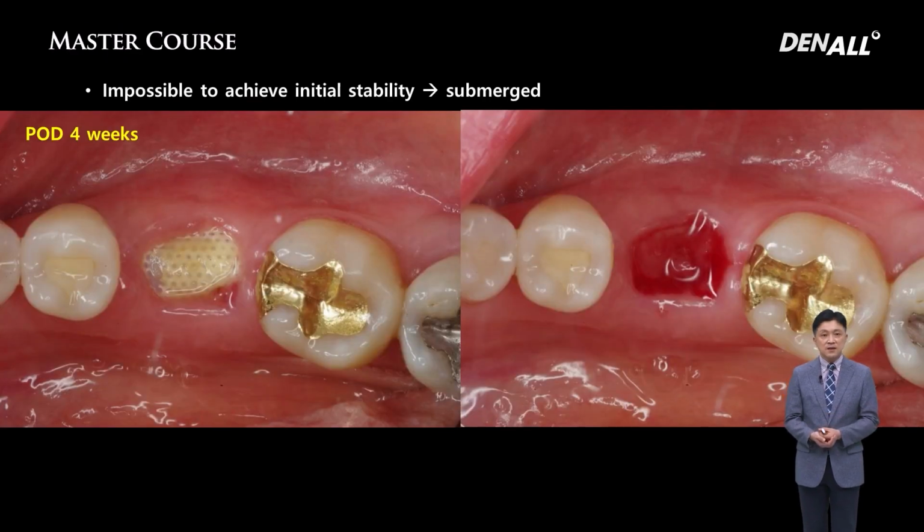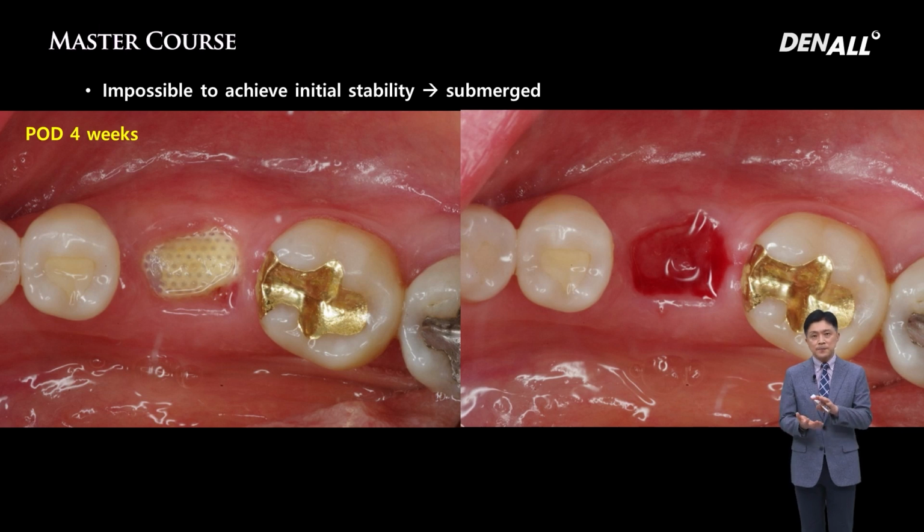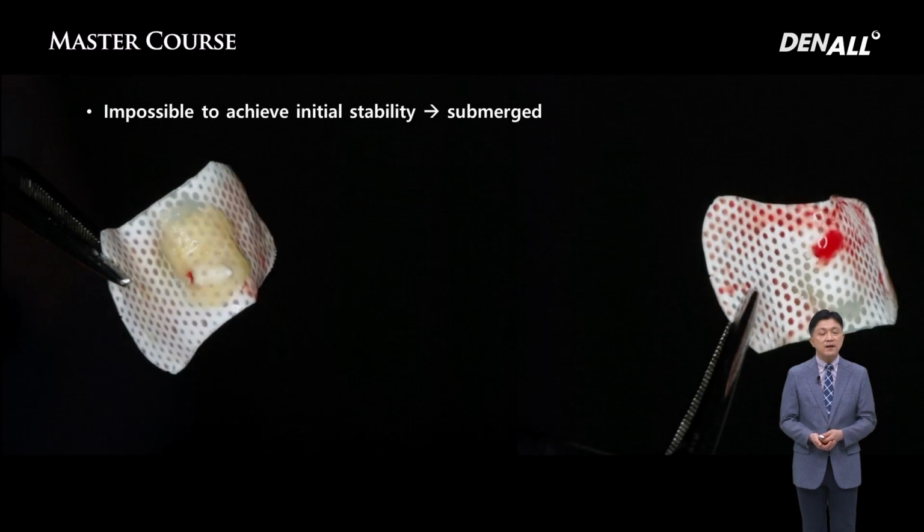On average, after 4 weeks, membrane becomes contaminated, and at 4th week, if you remove it using forceps, you can see pseudoperiosteum and not bone graft material. Below membrane, there's always a connective tissue layer of about 1 millimeter, and below that, bone regeneration occurs. Yes, there are collagen membranes that do not follow this process, but in most cases, there's approximately 1 millimeter of connective tissue layer. Even if you remove membrane, you don't see bone graft material, but connective tissue layer.